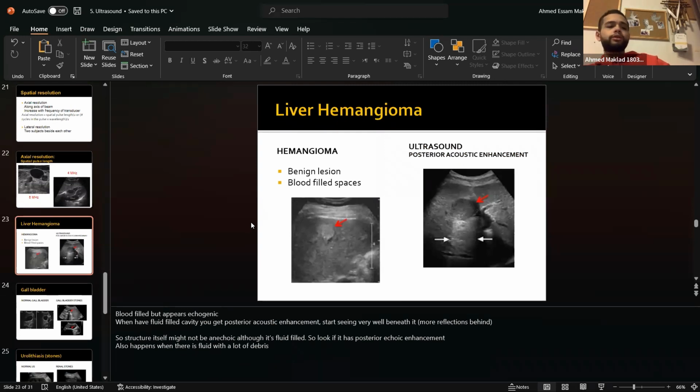All right, now we're talking about conditions or the clinical application of some of these things. Do you guys have any questions in the physics? The most important thing you need to remember is the piezoelectric crystal and how it works. And you need to remember that the spatial resolution is better with shorter wavelengths and higher frequencies. So that's what you need to remember from the physics, basically.